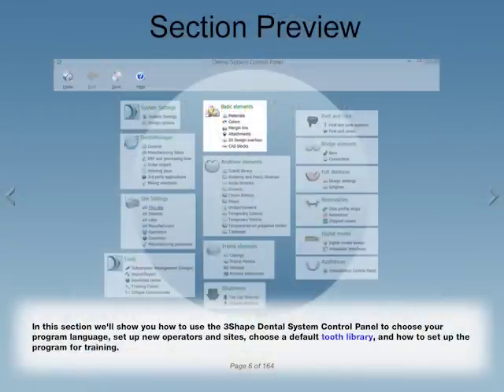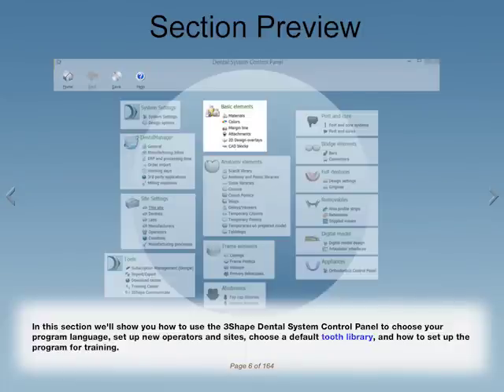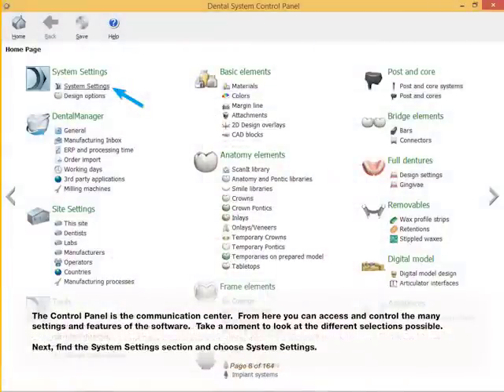In this section, we'll show you how to use the 3-Shape Dental System Control Panel to choose your program language, set up new operators and sites, choose a default tooth library, and how to set up the program for training. The Control Panel is the Communication Center. From here, you can access and control the many settings and features of the software.